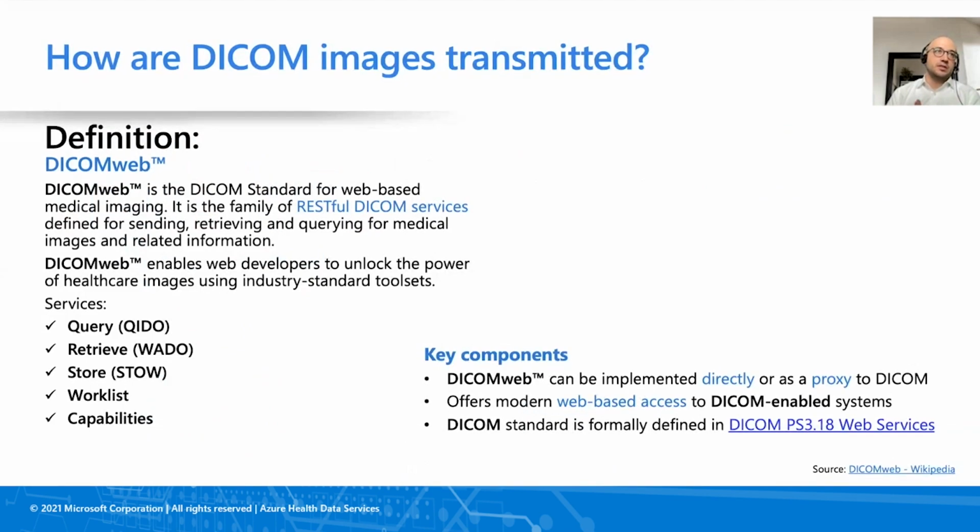So DICOM Web is the DICOM standard for web-based medical imaging, and our DICOM service is only compliant with the DICOM Web standard. It is the family of RESTful DICOM services for sending, retrieving, and querying for medical images and related information. As you can see, the transactions that we support are query, retrieve, store, and worklist. It's also another capability that we are actively working on to enable in our services.